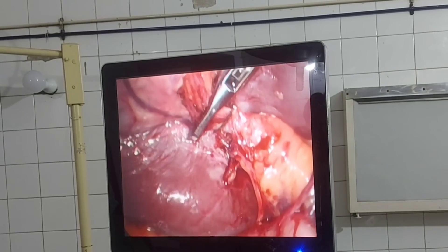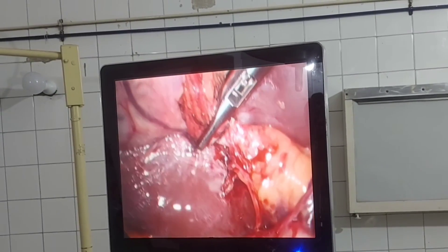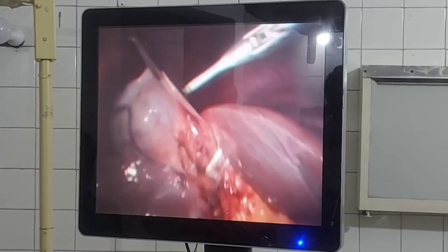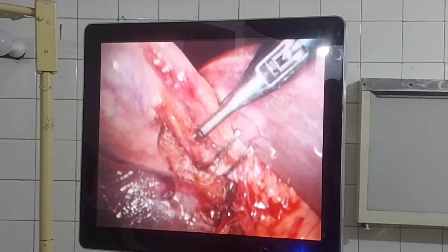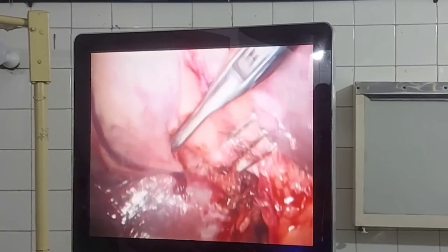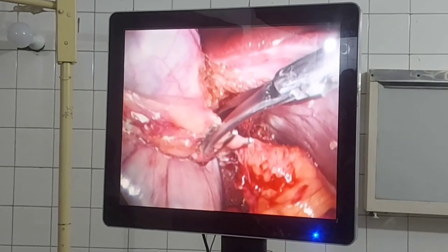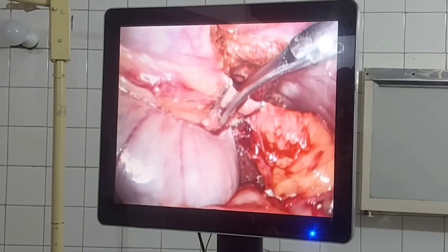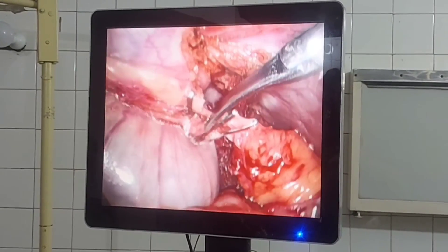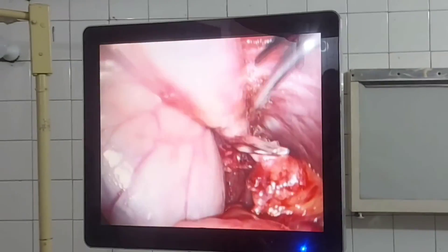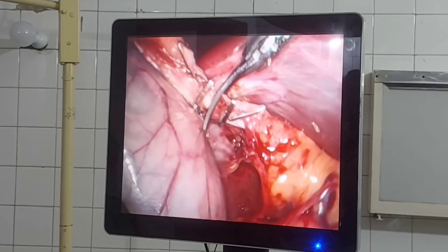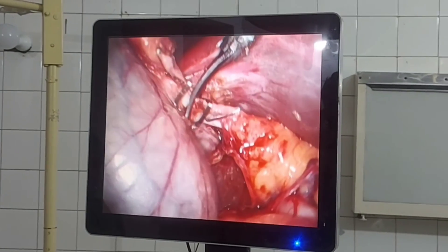We have ligated the cystic artery and cystic duct with metal clips, although preferably separate metal clips are used for cystic duct and artery. Now divide the cystic duct with scissors, leaving approximately three millimeters of tissue cuff toward the cystic duct. Two metal clips are left behind in the abdomen over the cystic duct area.